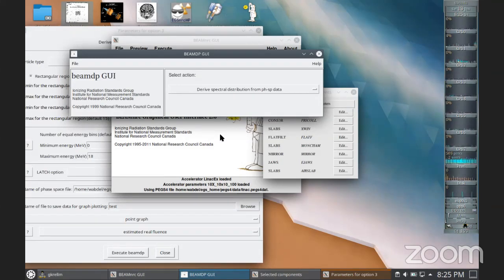Imagine if you have a wedge component in your beam model. And then you tell the system, okay, just duplicate my particles, make symmetry in all 4 quadrants. Then you will lose this wedge, right? Okay, but you can do that if you have that option in the dose calculation part, if you want. I think you can do that. Because then you're just storing a lot of particles in a file that is duplicated information.